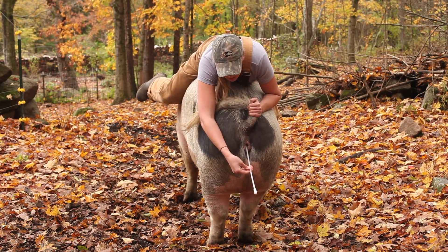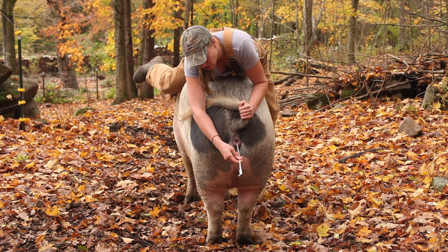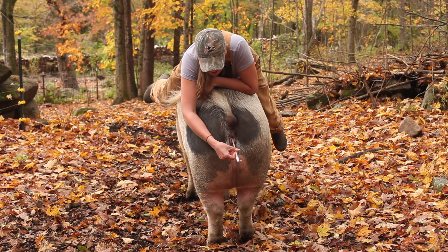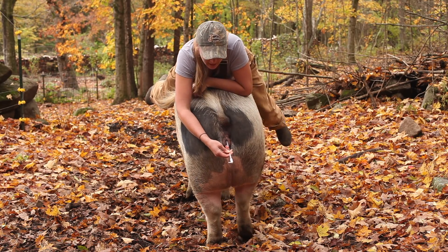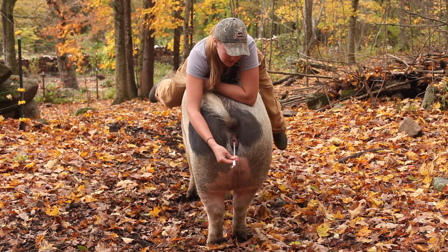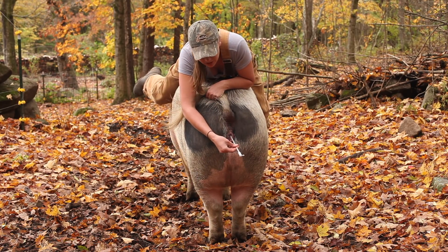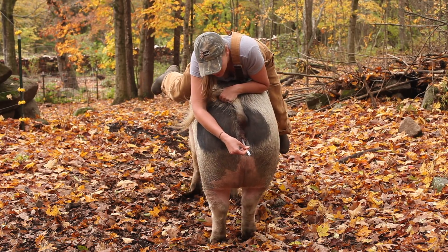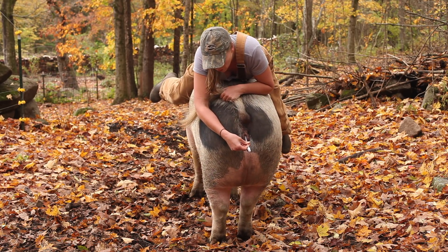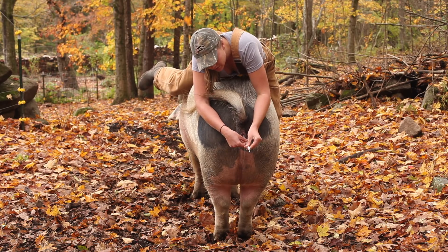I'm just gently pushing because I'm using a spiral catheter — you want to turn it counterclockwise to go in. You're just going to keep going until you feel like it has really stopped. Depending on the pig and how long it takes to reach the cervix, you may have varying amounts of tube sticking out. She feels like she's pretty locked in right there, so I give it a tug. It's not really going anywhere, but I'm still going to push a little further. She would let me know if I was going too far or if it was hurting her. Since she's not bucking or making any noise, I know I'm still okay. I really feel like I'm in there.